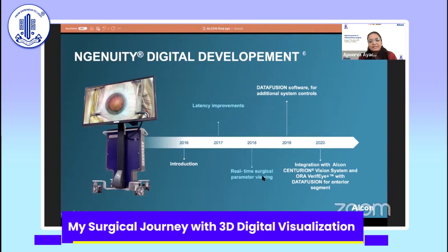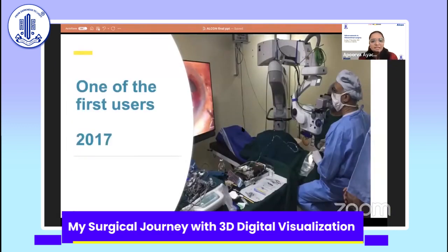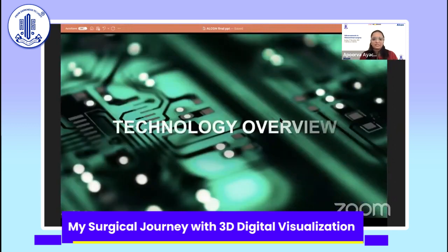And then in the latter part of 2018, real time surgical parameter viewing was integrated. In 2019, data fusion software for additional system controls was introduced. And in 2020, it was integrated with Centurion for the anterior segment. This has been our setup for the last 3.5, 4 years, and this is how our OR setup looks. This is about 1 to 1.2 meters away from the surgeon, and this is where the assisting tray is, and this is where our assistant stands. This is the surgeon, and that side is the observer or the surgical assistant.